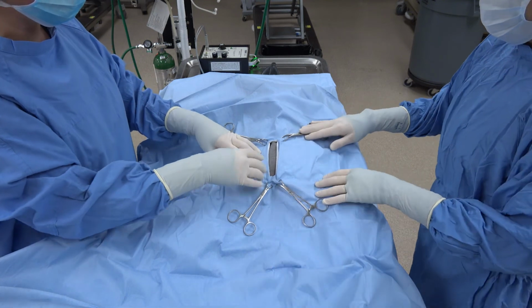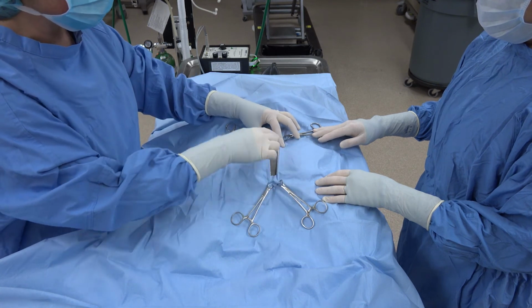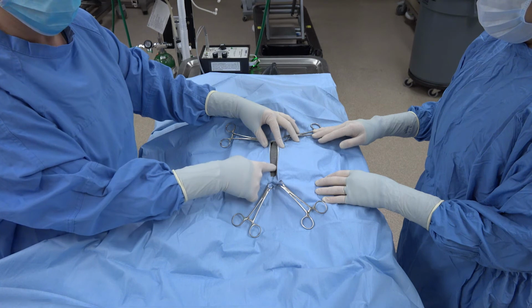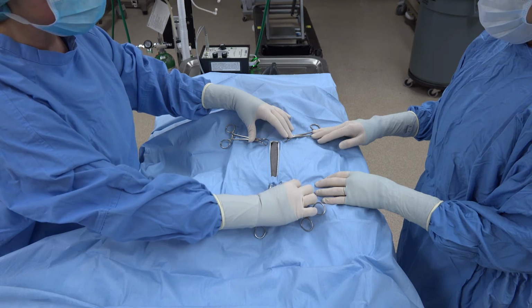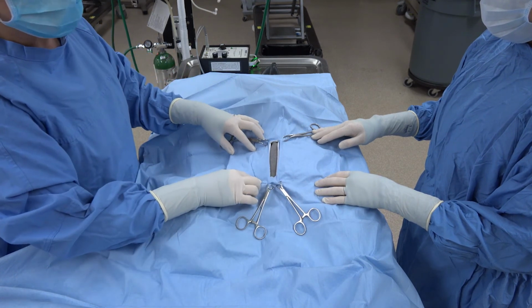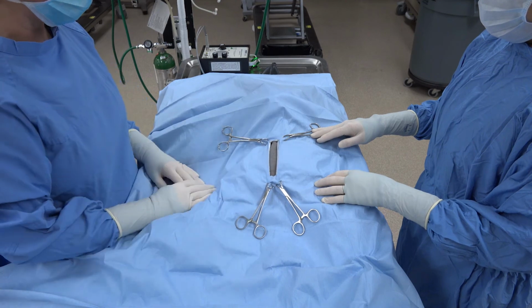If you did it this way and your little ends keep flipping out despite your towel clamp placement, you can just cut it off. But you notice that I don't have a ton of four-quarter drape showing. A little bit is okay, but if you start putting towel clamps back here, you start to contaminate your area. And if you have huge amounts of white towel showing from your four-quarter drapes, then you potentially have a problem with contamination as well.